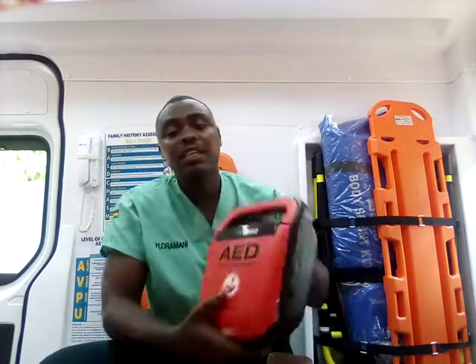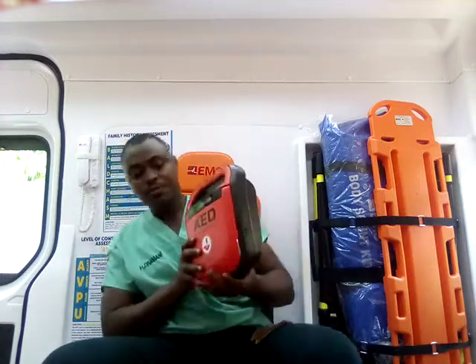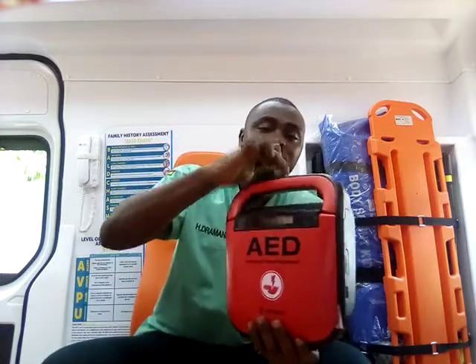Today, I would like us to discuss how to use the automated external defibrillator, specifically the Hearton A15 MEDIANA AED device. To start with, let's look at the parts of this device. Now, this part is what we call the handle. At the same time, the battery.